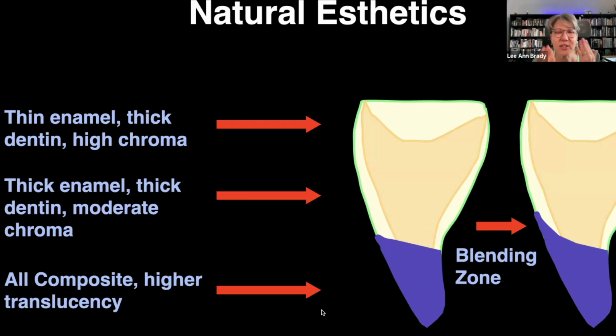Okay. We can literally see that differential and we can actually find where they touch each other, which is what we call the margin. Our brains get way less good at differentiating that, and they actually start to blend the two varying materials. If we have the solid material A, and we'll call that tooth, and solid material B, we're going to call that composite. And between those two things, we actually have a zone where tooth and composite are layered on top of one another, and they're in changing or triangular shaped thicknesses, right?